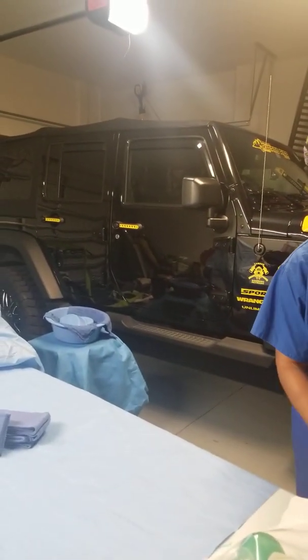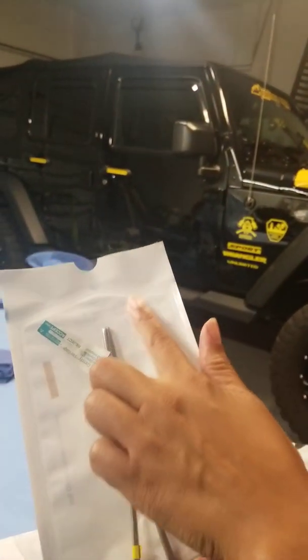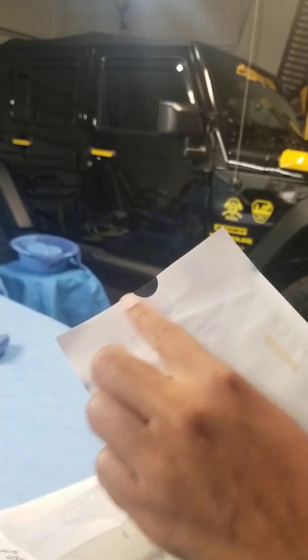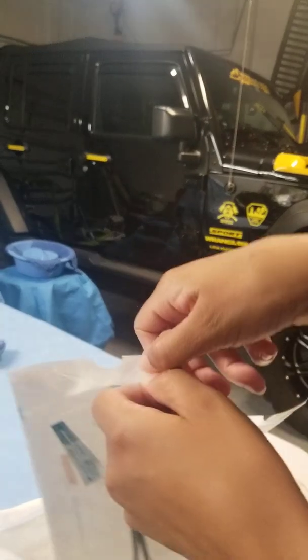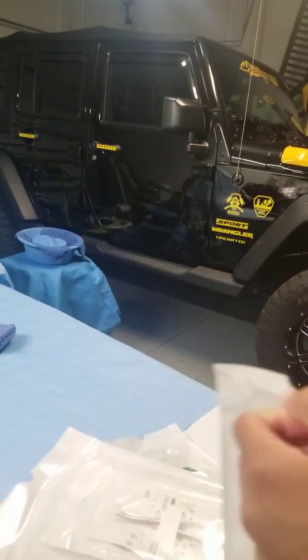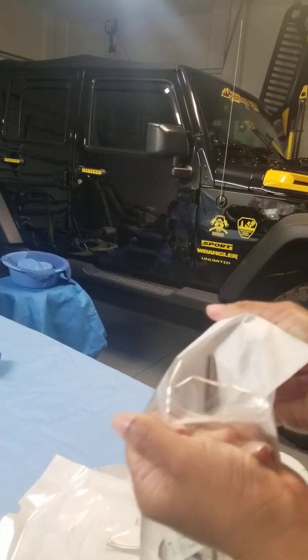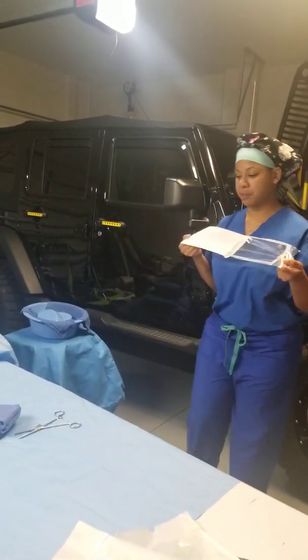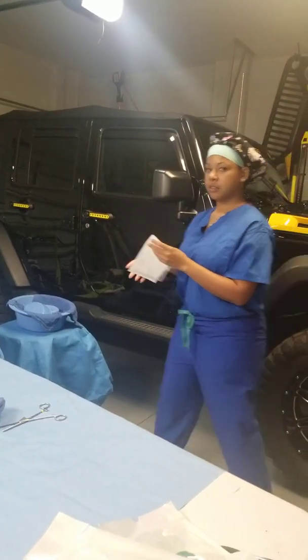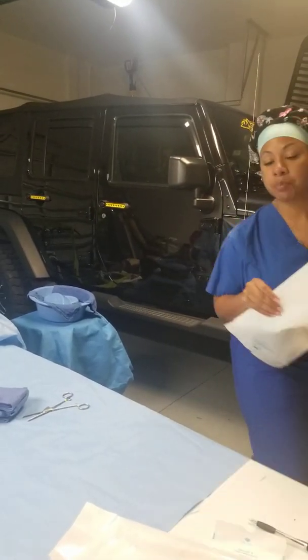Next, we're going to open our peel packs. When opening a peel pack, you have the house, your roof, and then there are little indents which keep the seal together. You're going to pop that — long thumbs — and slowly peel apart. When doing that, you're going to come over, drop, and come back. It's best to check for moisture or anything before you start.